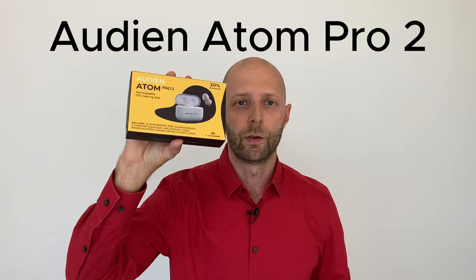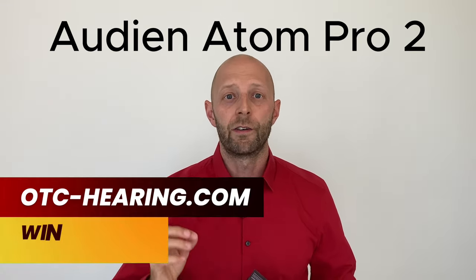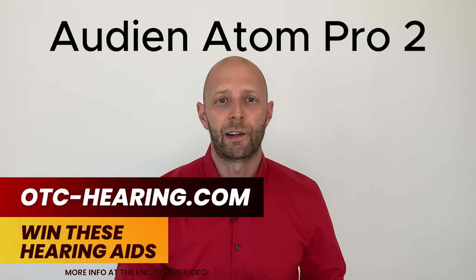Hey, what's up? You are watching Dave the Hearing Aids Guy, and today I'm reviewing the Audien Atom Pro 2 OTC hearing aids — how they look, how they sound, and how you can win a pair of these hearing aids.